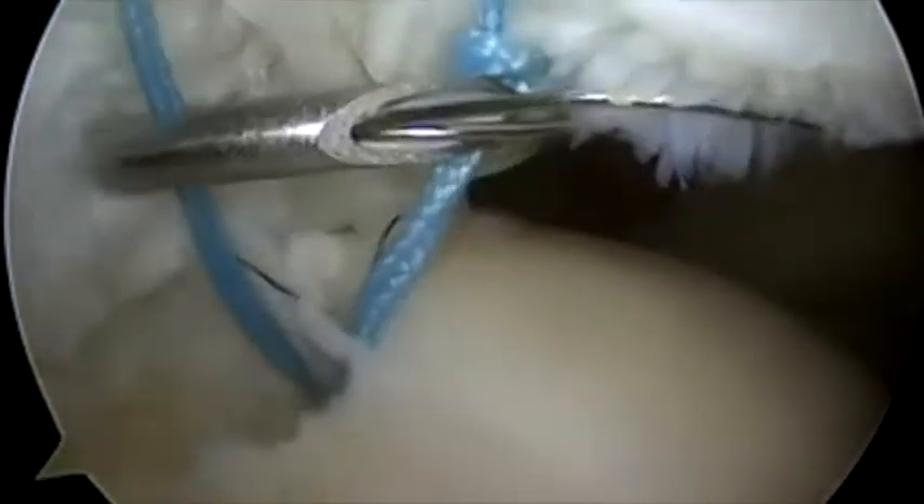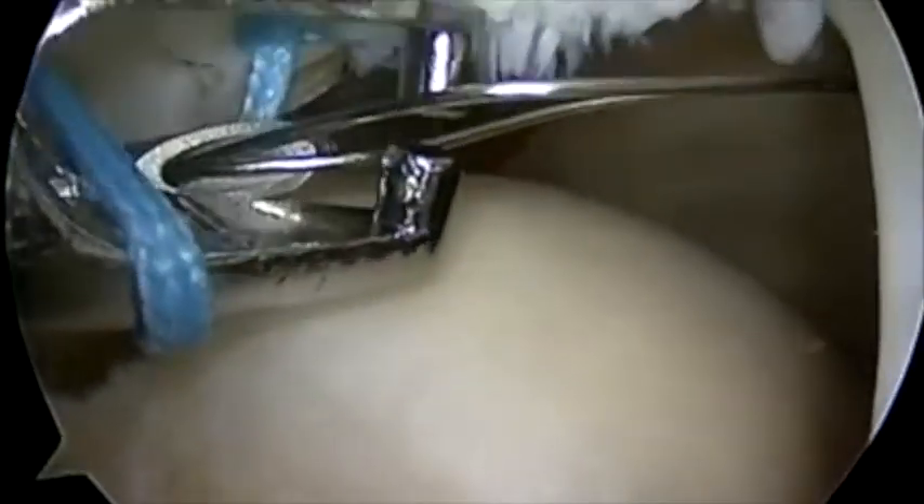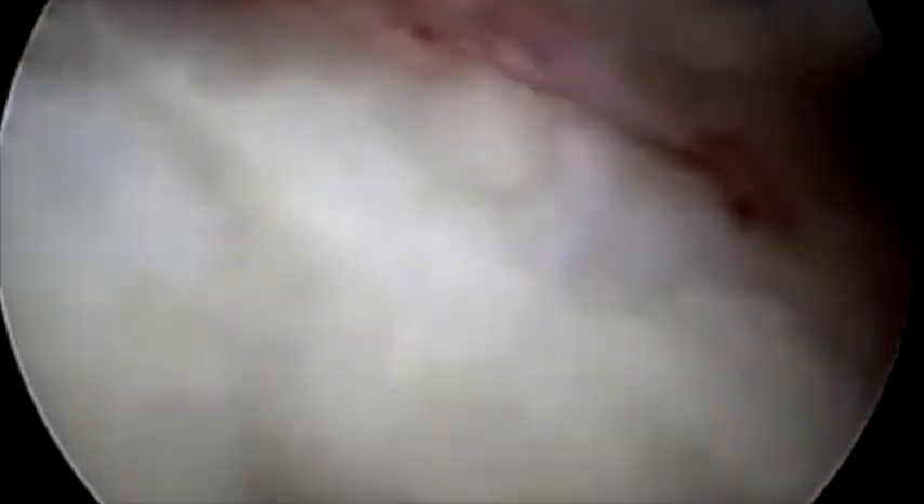Both limbs of suture have been passed posteriorly while viewing from the anterolateral portal. A spinal needle is introduced through the lateral remnant of tendon. The corresponding limbs of suture are then retrieved in order to create a side-to-side repair.